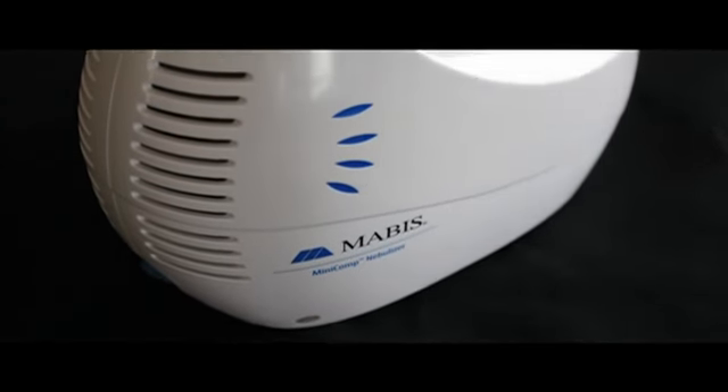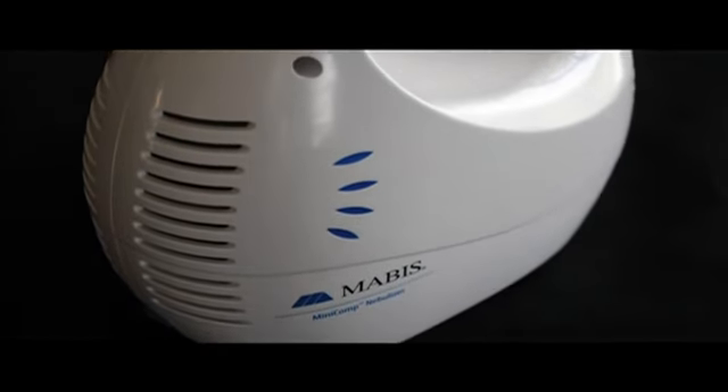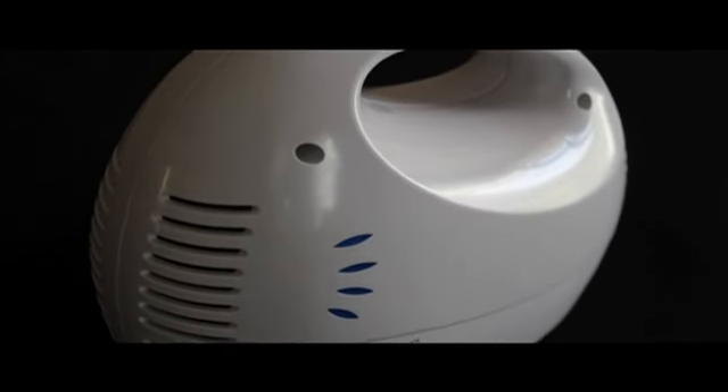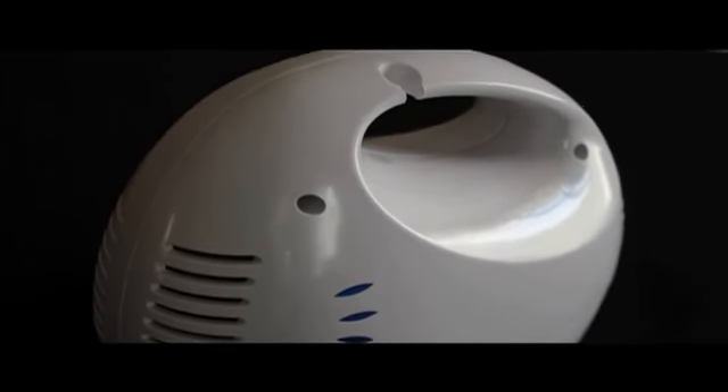This is the Mabis Mini-Comp, a compressor nebulizer that effectively delivers aerosol medication for the treatment of asthma, COPD, and other respiratory ailments.